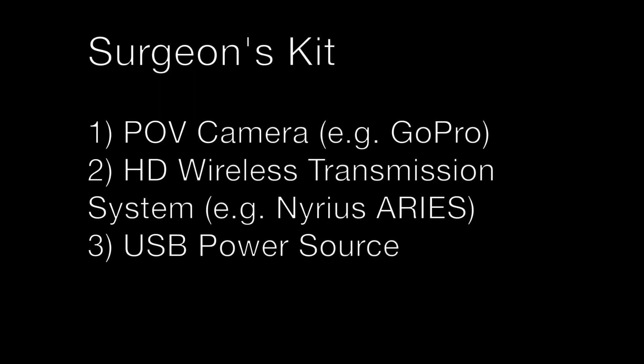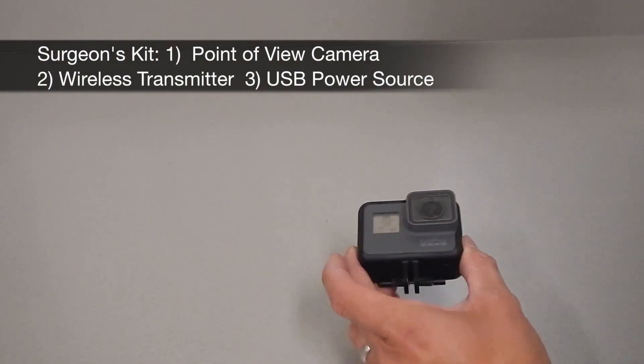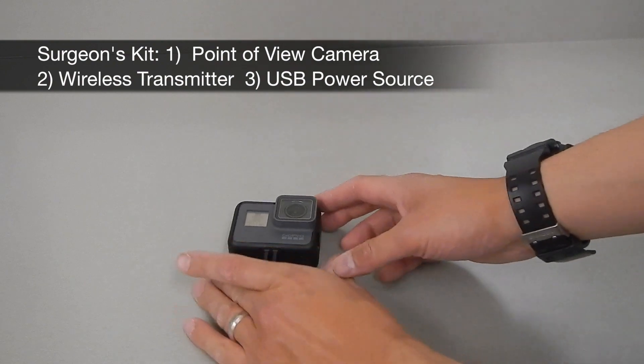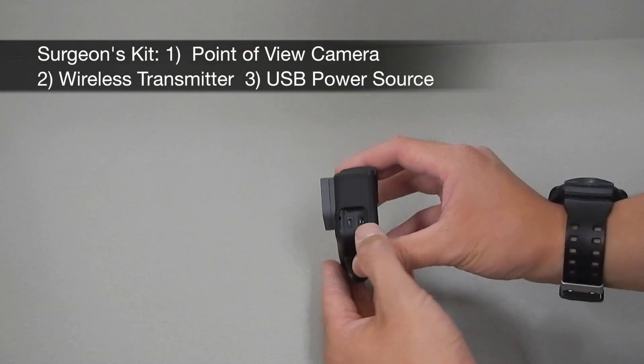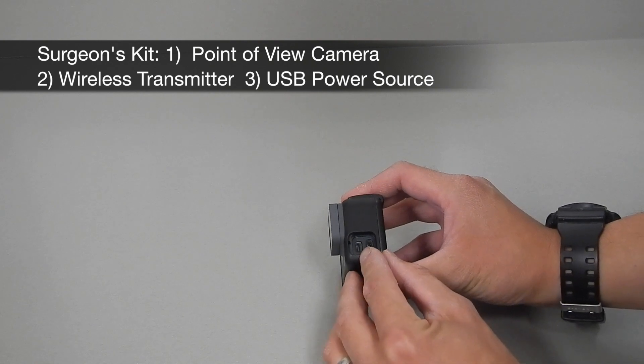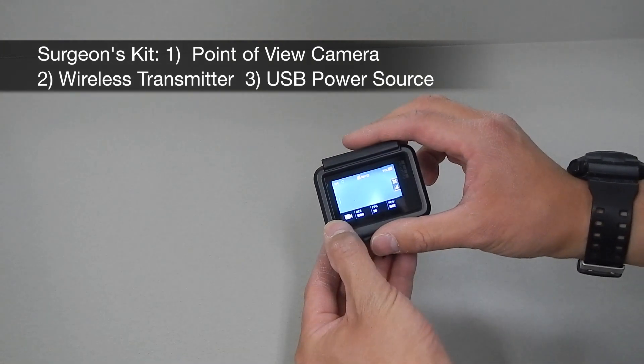This entire system can be put together using off-the-shelf consumer technology, and some of the examples are written here. The first part of the surgeon's kit is the point-of-view camera, and in this HERO5 depicted here, you can see on the side that there are two inputs: one for a USB power source and the second one for an HDMI feed.